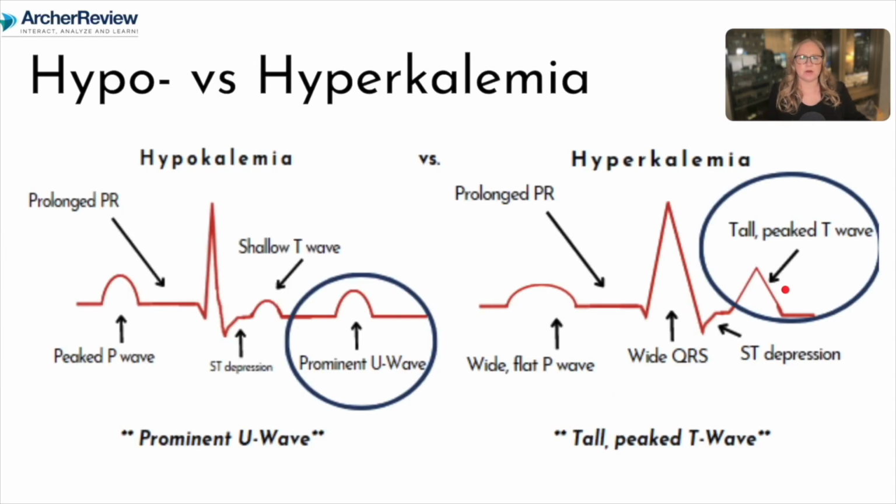So let's compare here. In hypokalemia, we see that prominent U wave. In hyperkalemia, we see that tall peaked T wave. Those are the most important findings for potassium in your EKG.